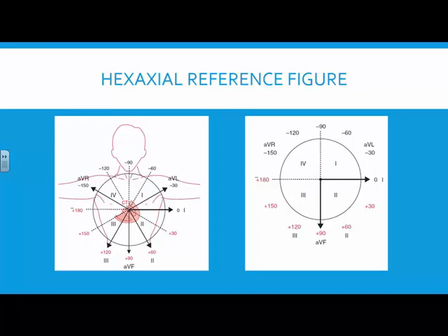If I'm taking a picture in lead 2, we're looking at it as it's coming down.